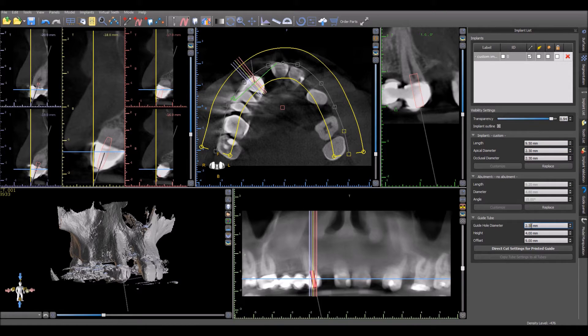The guide hole diameter should also be a tenth of a millimeter larger than the tool that's going to be used.